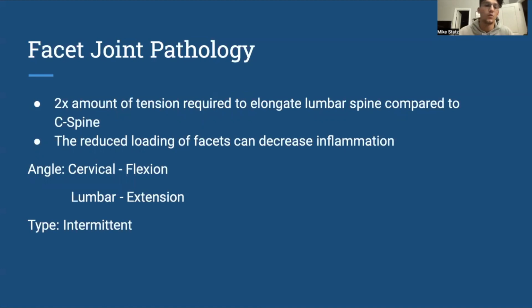And we're going to be looking at cervical traction in flexion and lumbar traction in extension. Once again, we're going with intermittent traction, holding for a period of time, relaxing for a period of time, and then holding again.